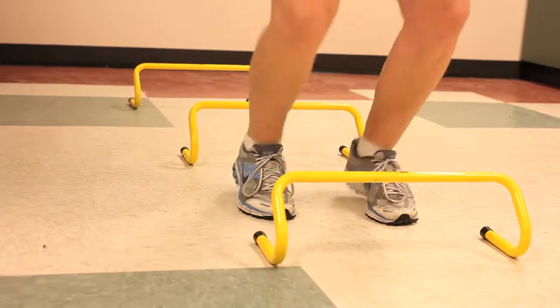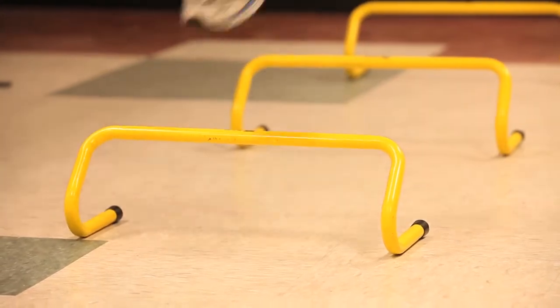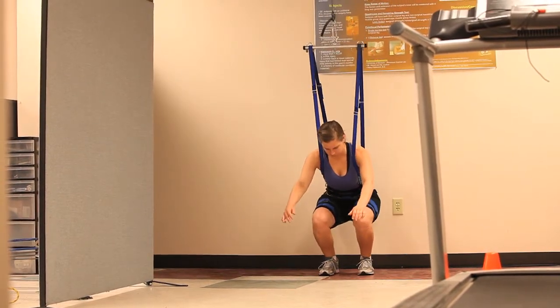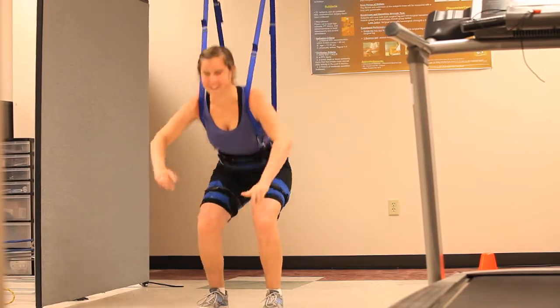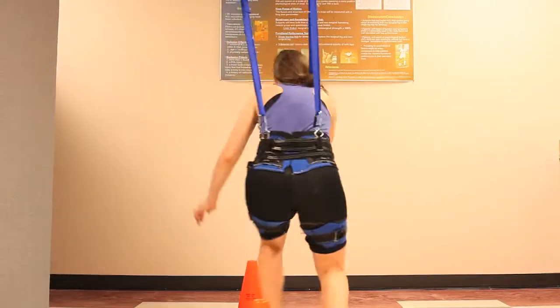So we came up with this idea to use some of the unweighting tools that we use in our new directions clinic — like retraining people with stroke or spinal cord injury how to walk again — to retrain our athletes how to do cutting, pivoting, and jumping again. The problem with existing unweighting tools is they're really fit for on top of a treadmill in a very narrow range, so we needed something much more dynamic that gives a very consistent force up and down and side to side.